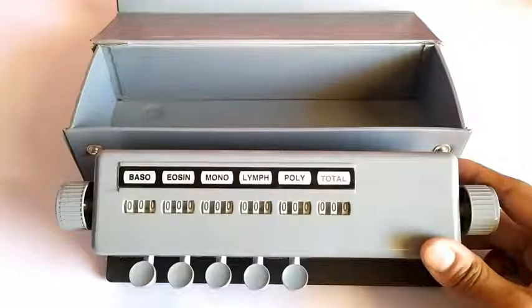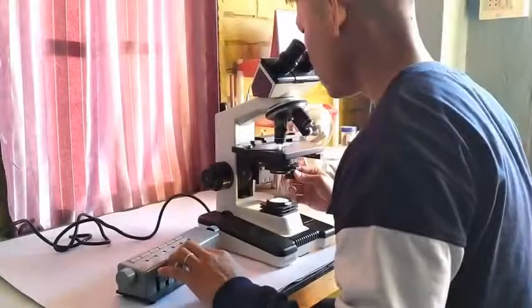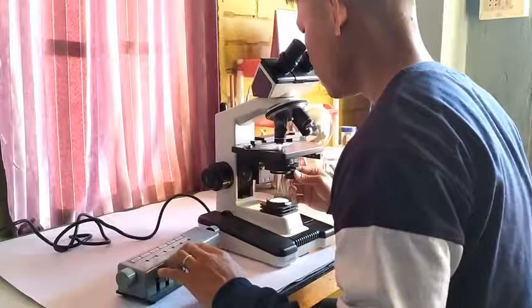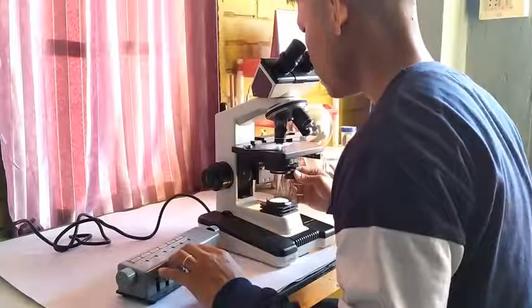In this regard, a convenient feature of the cell counter is that once the total count reaches 100, the counter makes a single loud ring using its inbuilt ringing bell, much like the calling bells used in office spaces. This allows us to perform an undisturbed counting without having to constantly check the counter to see whether or not the total has reached 100.